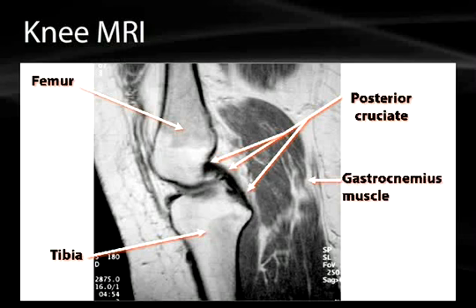Here's another knee MRI showing the great grayscale of the muscle fibers, especially the gastrocnemius. You can see the posterior cruciate ligament coming off the femoral condyle down to the posterior aspect of the tibia — notice how it appears as a lucent structure on this MRI.